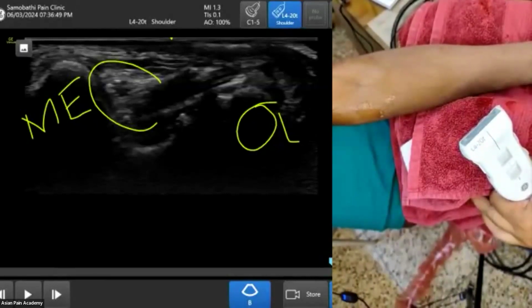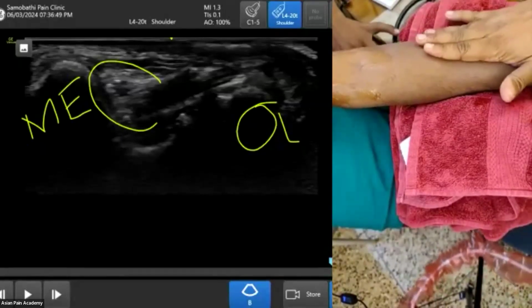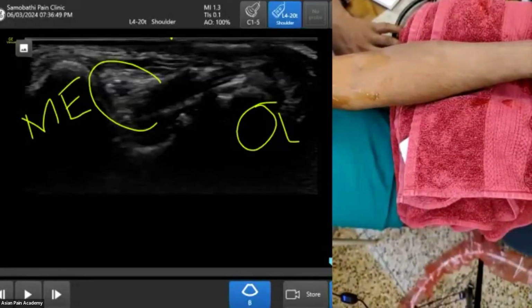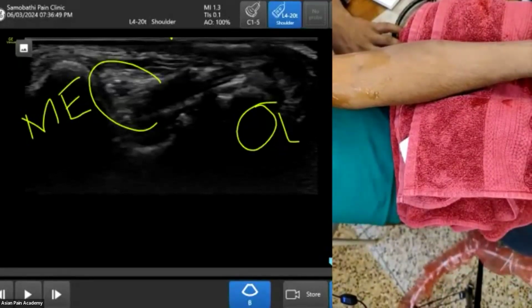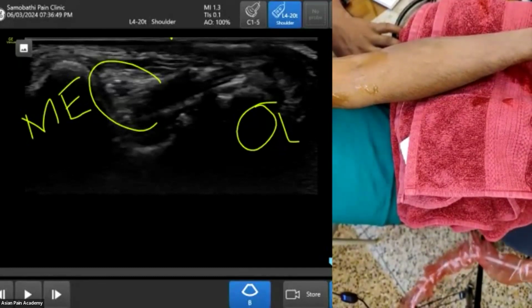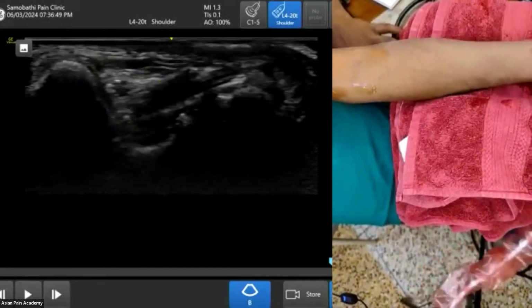So you show them the superficial radial nerve, I think. The carpal tunnel we have covered already; we already had a class. So the median nerve in the forearm we have not covered. Okay, let's show it in the forearm. Then I will go to the superficial branch. So let us trace it here.